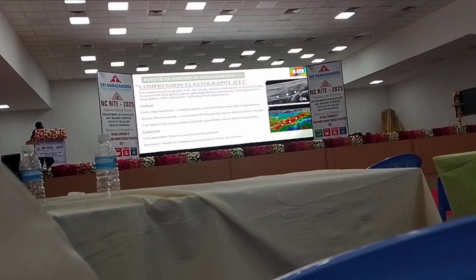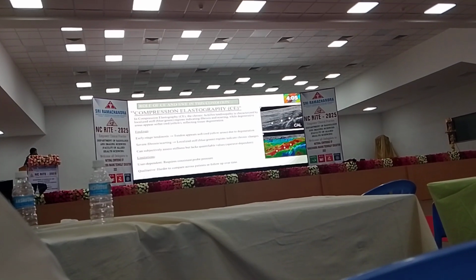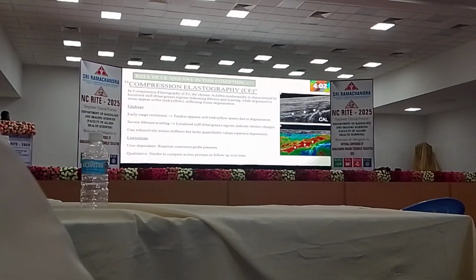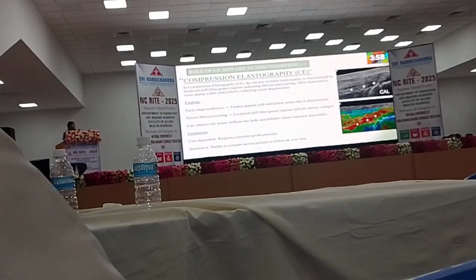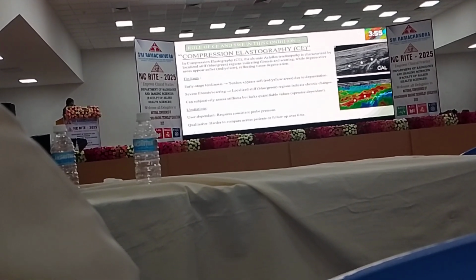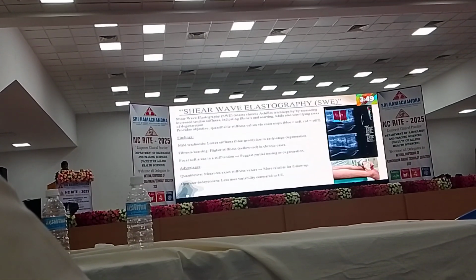And that mainly develops due to severe fibrosis and scarring, which can eventually lead to the tendon being broken. Here, we could see the amount of application and findings which is present here, but it has very much limitations, making it inadequate. It's very user dependent and requires consistent pressure. While it is qualitative, it's harder to compare across patients over follow-up over time.